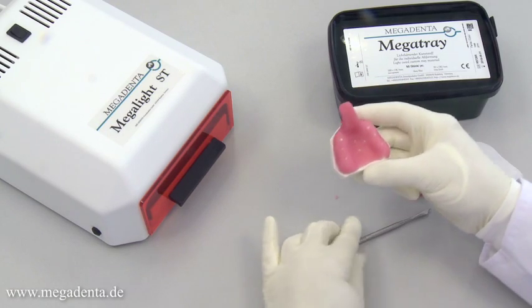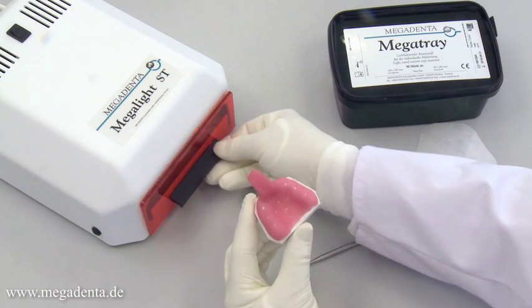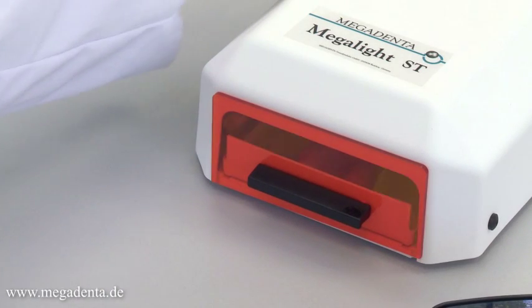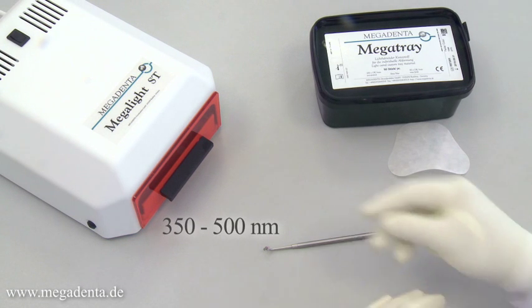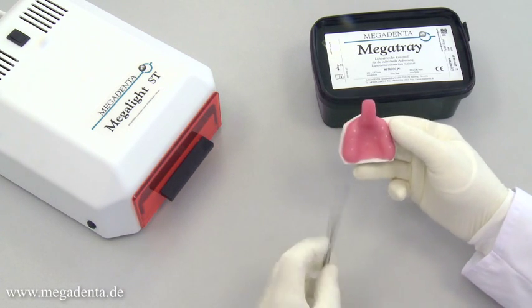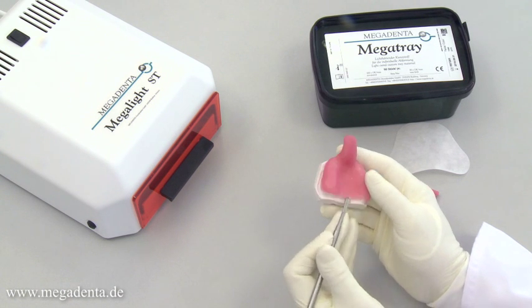The prepared wafer is now ready for light curing. Megatray can be cured in all commercial light curing devices with a spectrum between 350 and 500 nanometers. The curing time depends on the spectrum and intensity of the device. In the recommended light unit Megalight, it will be five minutes.